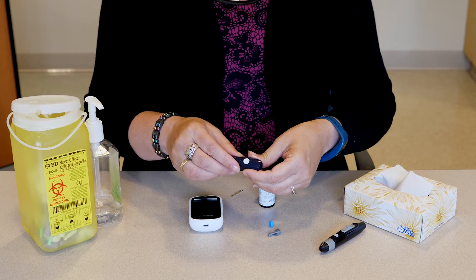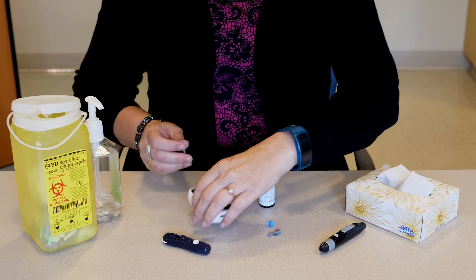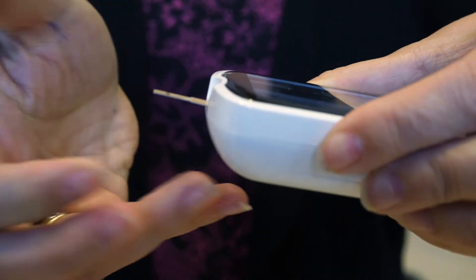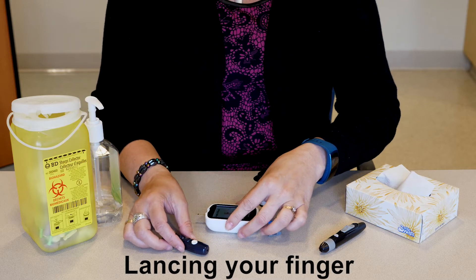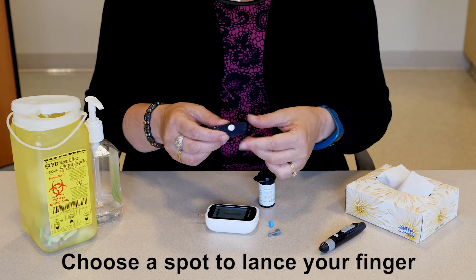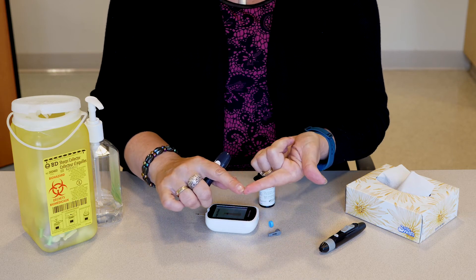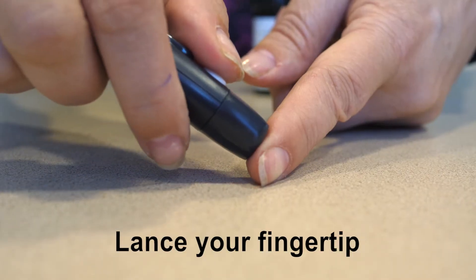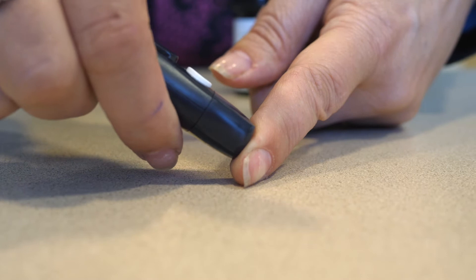Insert a test strip into the meter. Part 2: Lancing your finger. Choose a spot to lance your finger — using the side of the fingertip may be less painful than the pads. Use the lancing device to lance your fingertip by holding it in place and pressing the release button.